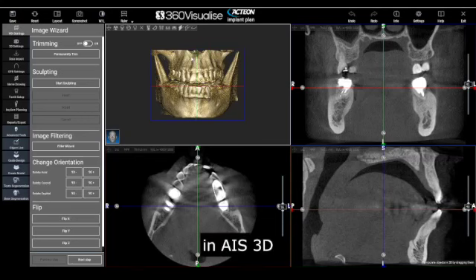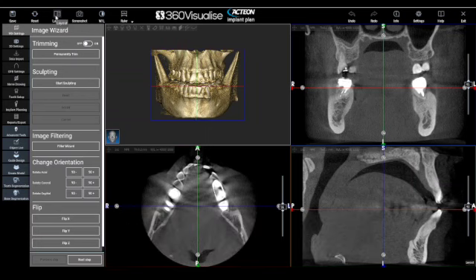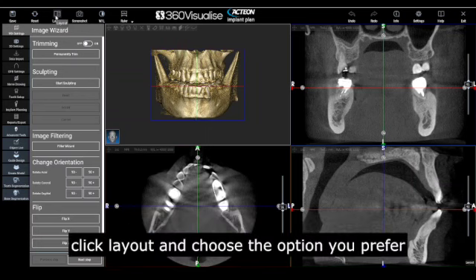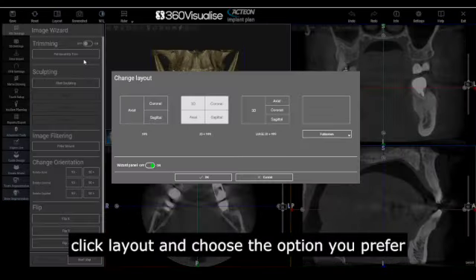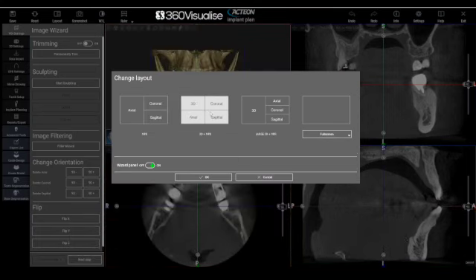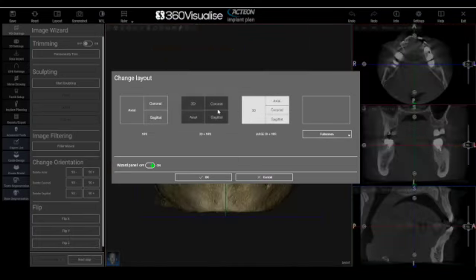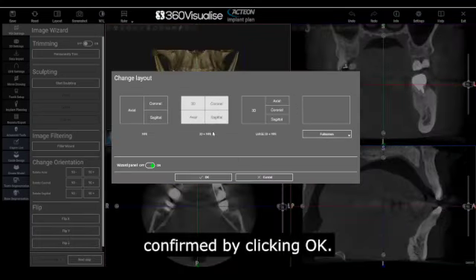In AIS 3D we can change the views by using the layout button near the top left corner. Click layout and choose the option you prefer. Confirm by clicking OK.